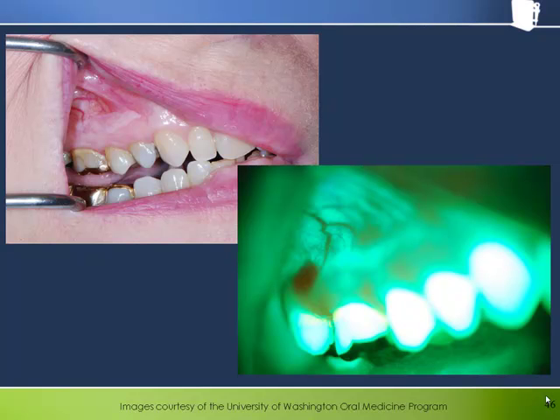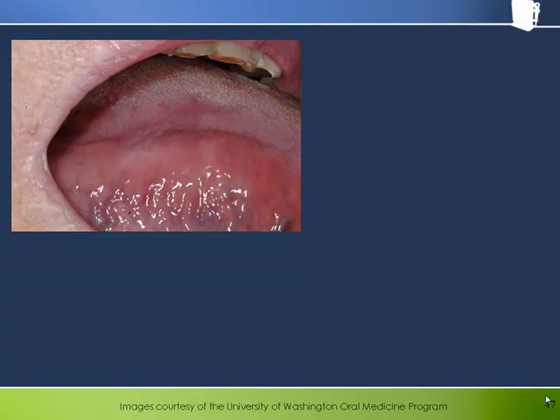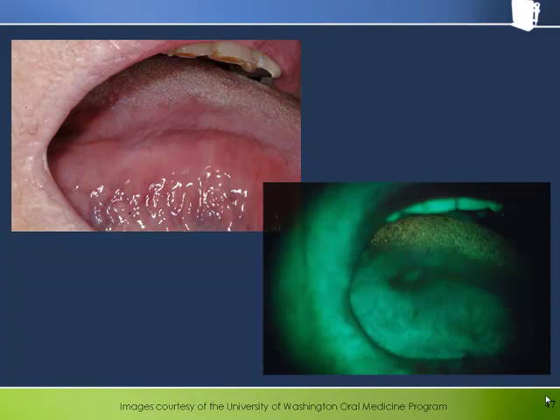Note that the leukoplakic area anterior to the lesion does not seem to show a loss of fluorescence. Here we have a somewhat subtle leukoplakia on the lateral border of the tongue that appears quite striking and dark under fluorescence. This lesion was biopsied and found to be dysplastic.